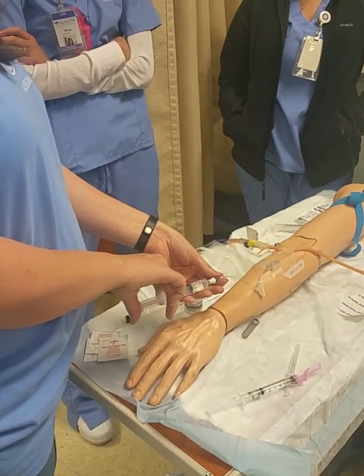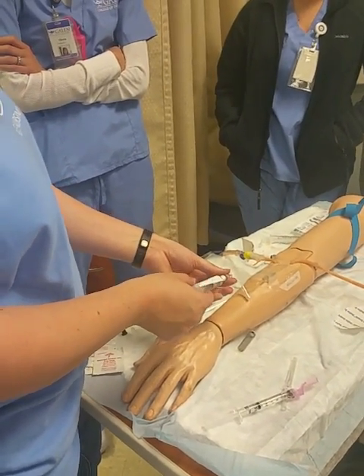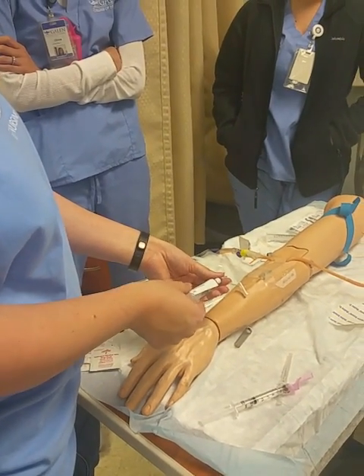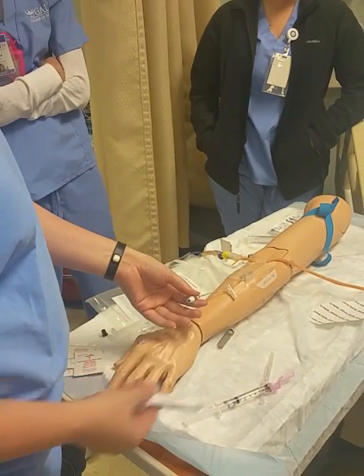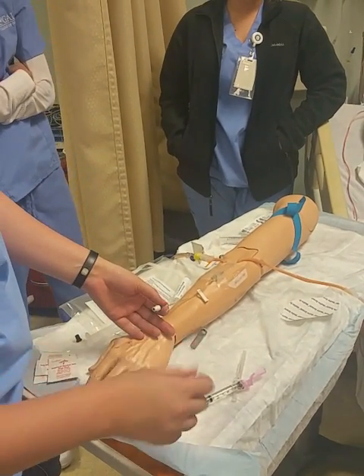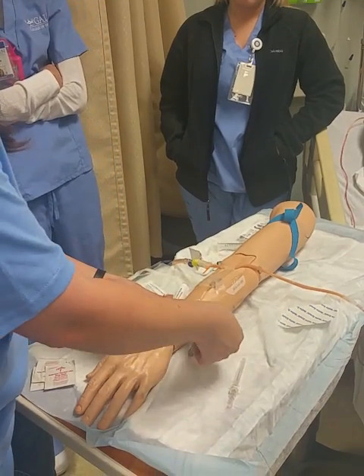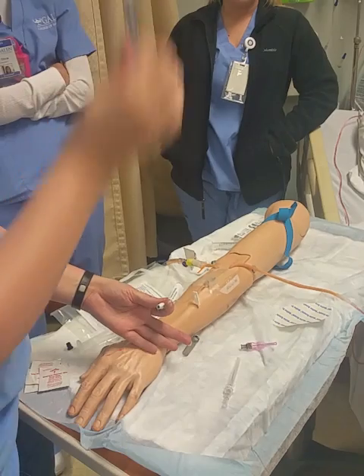10 cc's, right? Or is it 5? Facility policy will dictate 10 versus 5. If your patient doesn't have any kind of fluid volume issues, 10's not going to be a big deal. But if you've got a heart failure patient or fluid restriction patient, you may only do 5. I'm only doing 5 because I know I'm not in the vessel and I know where this fluid is going. Okay. I'm going to take the needle off of my Lasix. Get rid of my air bubble.